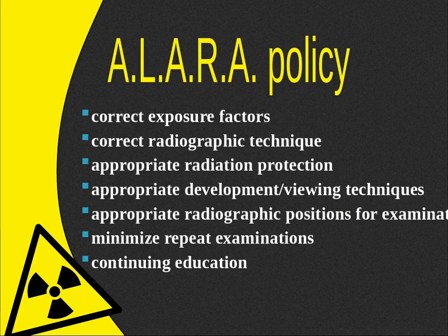The ALARA policy here for the technician is to use the correct exposure factors for your patient, correct radiographic techniques for the patient, and appropriate radiation protection for yourself, and appropriate development and viewing techniques. You should also have the appropriate radiographic position for the examination, minimize as much as possible the repeat of examinations, and be educated with all the updates on how to protect yourself and the patient.